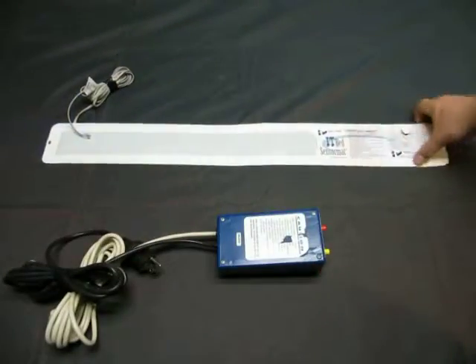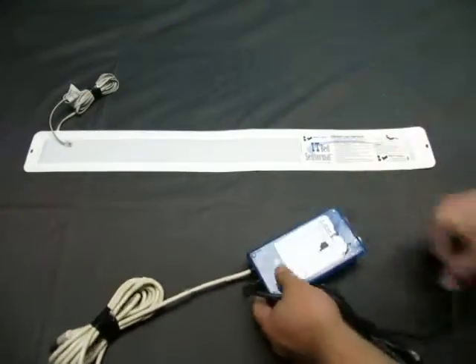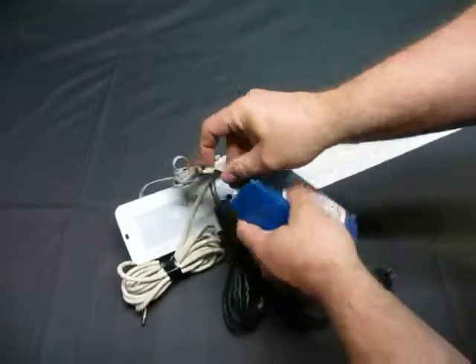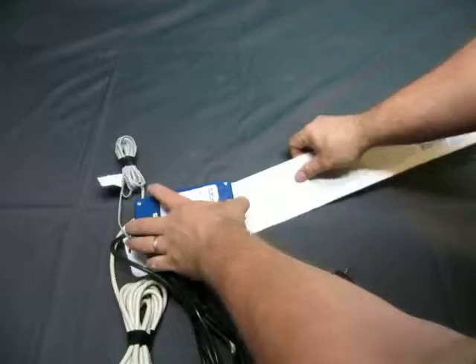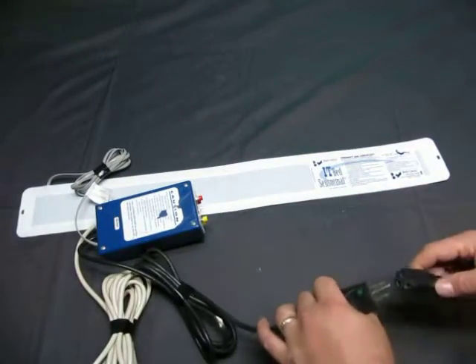It's supposed to be used with the sensor mat — there we go. Let's plug it in and see if we can get this thing to actually work. I'll plug that in there. Let's grab an extension cord.